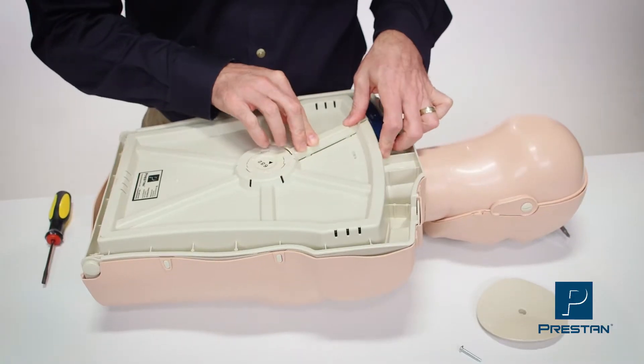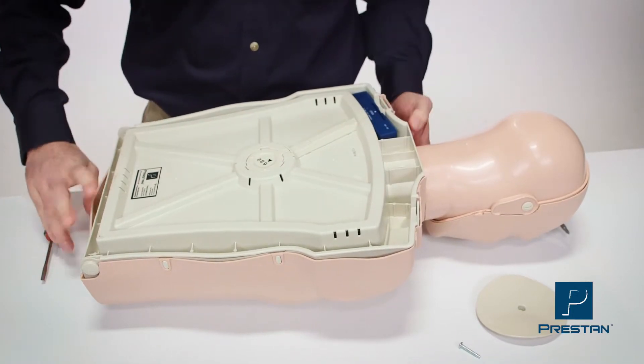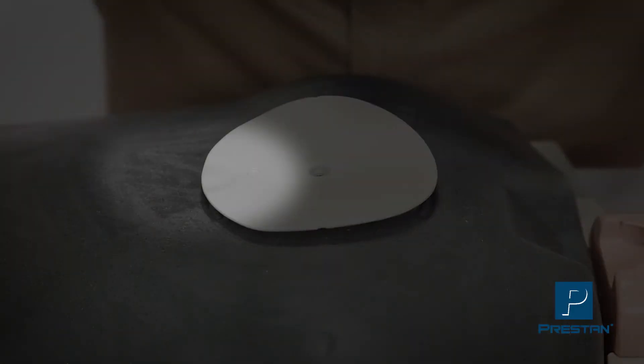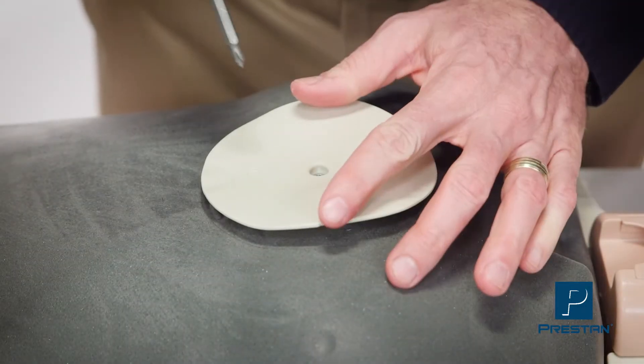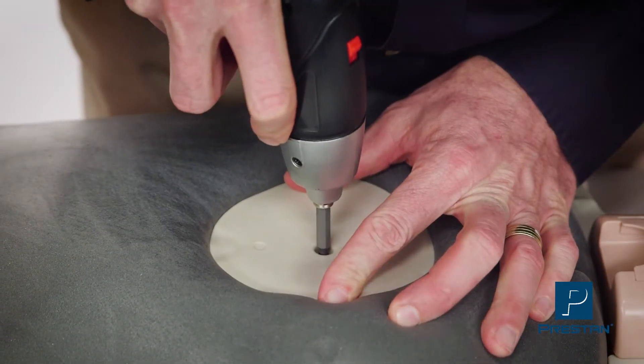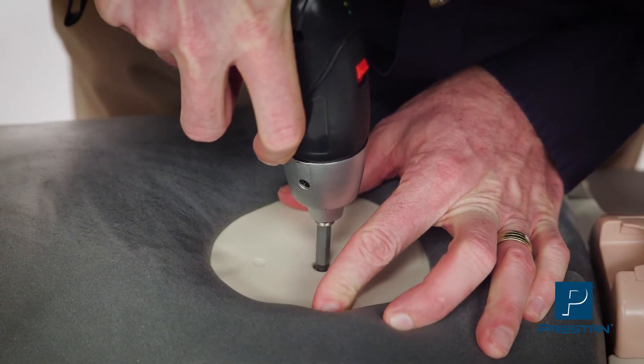Turn the mannequin back over and align the new chest plate with the xiphoid process guide facing the bottom of the mannequin. For best results, compress and hold down the chest while tightening the screw — a cordless screwdriver is helpful for this.